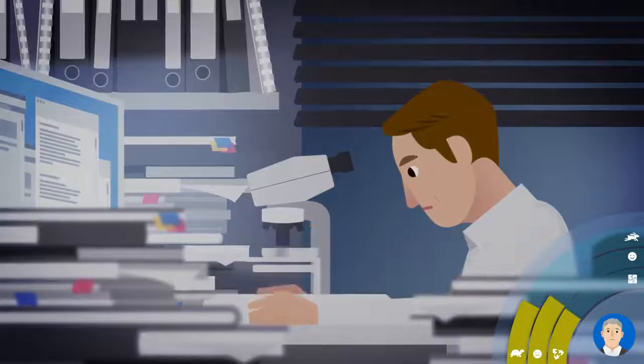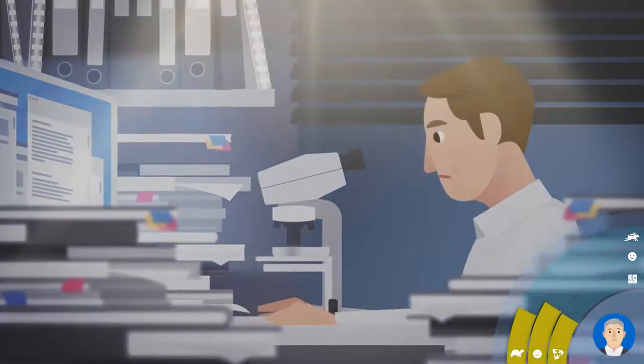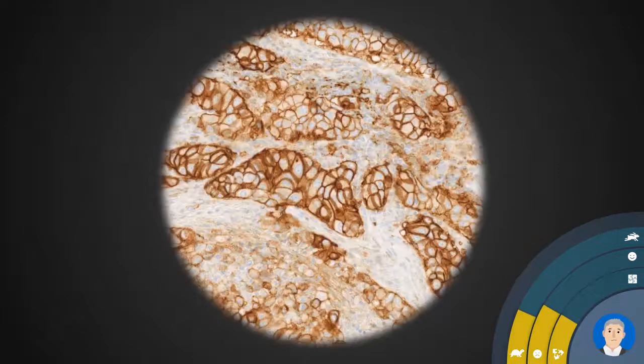The pathologist has to manually view, assess, and annotate the tissue slides using a microscope.